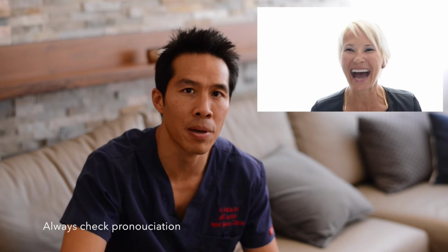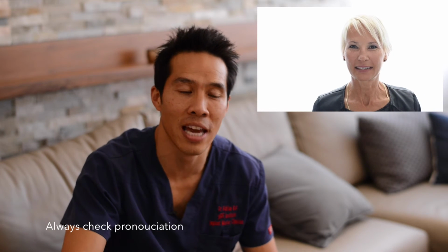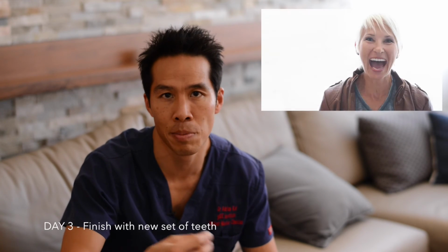The most important aspect too of this is not only that the smile is correct and the bite is correct, but that the phonetics are actually correct, so that the patient's pronunciation and words sound correct, and that's something that we can also test at this visit. On the Wednesday, what happens is that Patrick will then take that and convert it to the final all-on-4 bridge, and that gets placed in on Thursday.